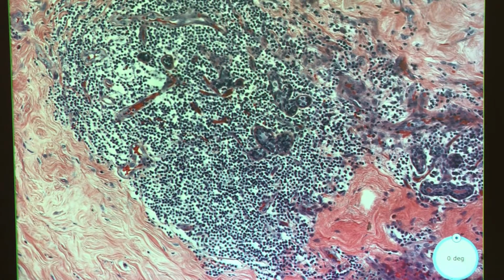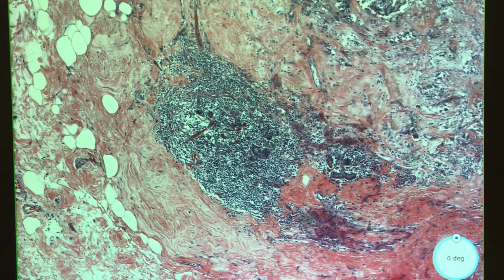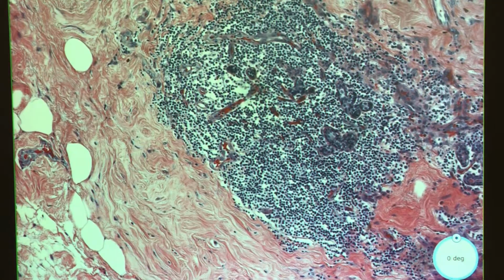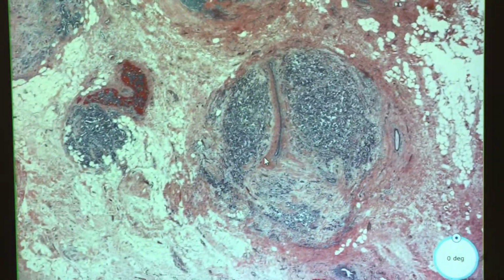Maybe a little something that we saw last week, maybe some aspect of lymphocytic mastopathy or diabetic mastopathy here. Because remember, we have like this very glassy island, all these lymphocytes, and then relatively normal looking glands in there. But I think that's an additional finding.